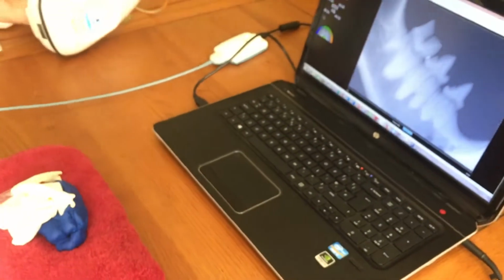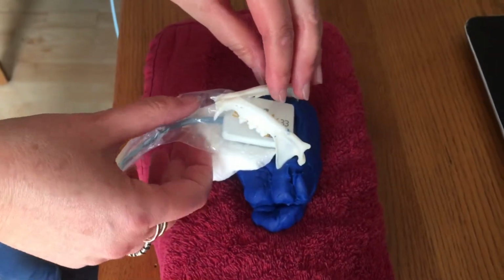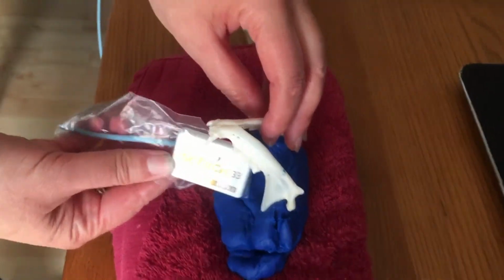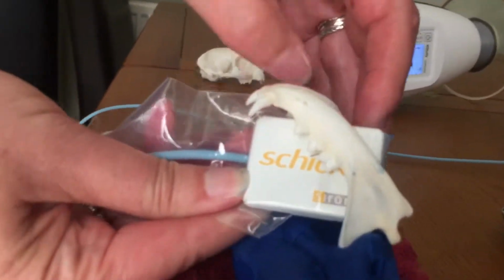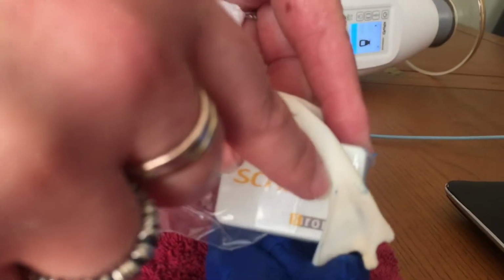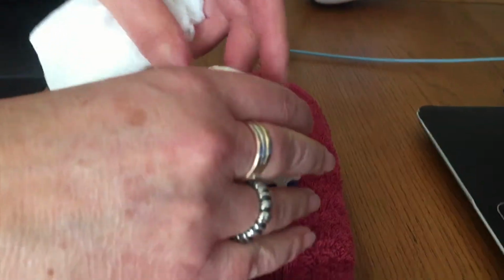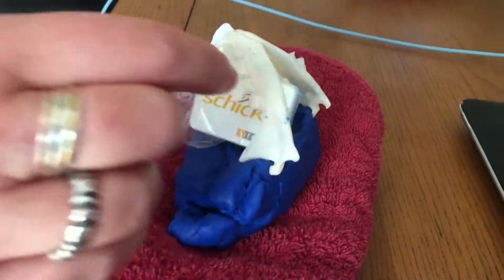There is another way of doing it, which is to take, instead of using that bisecting angle technique that we were just using there, you take the sensor out of the animal's mouth and you put it in like this. It doesn't really matter, to be honest, whether it's like that or like that. Just put it in as far as you can so that you're right up against that last molar. And if I can do this and hold in place at the same time. But basically you're just firing straight on there. You're not firing at a bisecting angle, you're just firing straight on at the sensor. Let me see if I can do that. So you're just basically firing straight on at it.